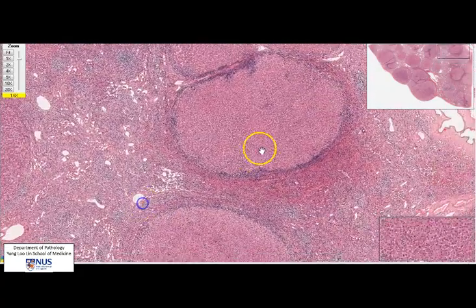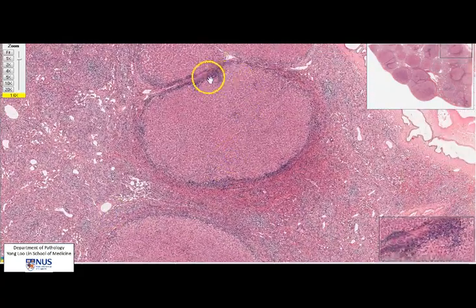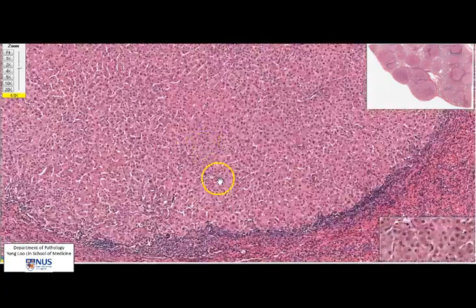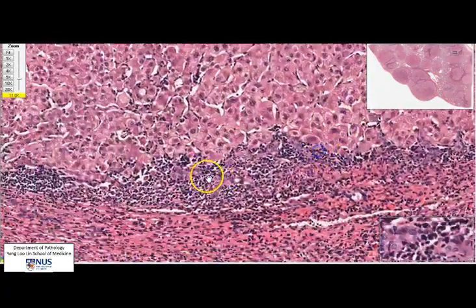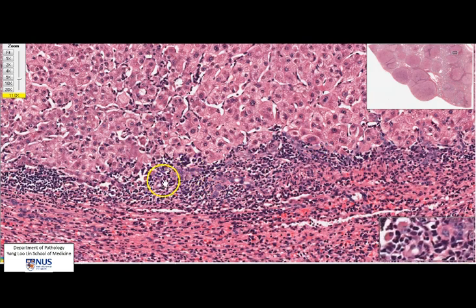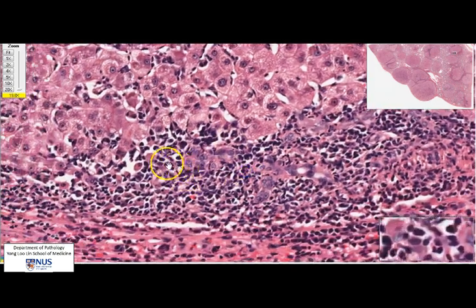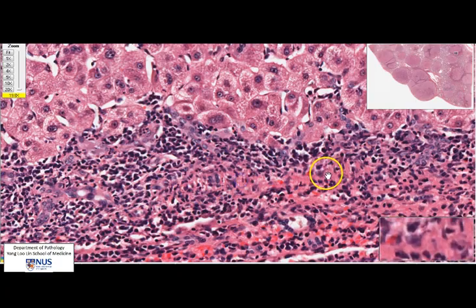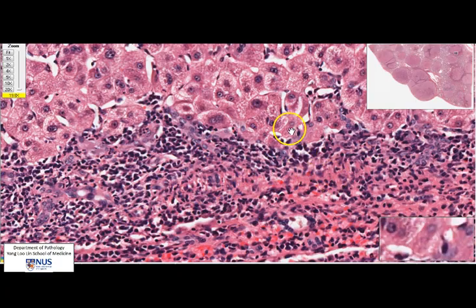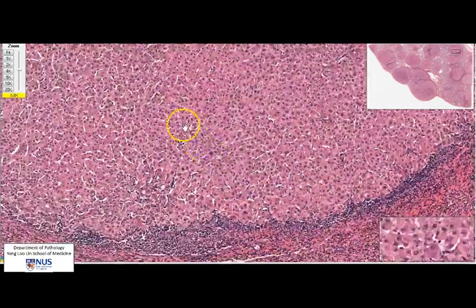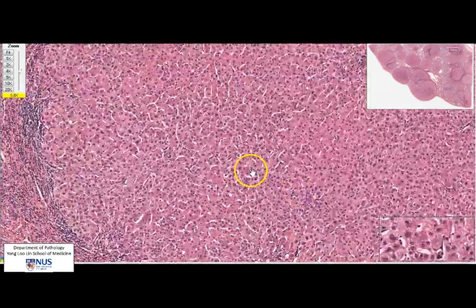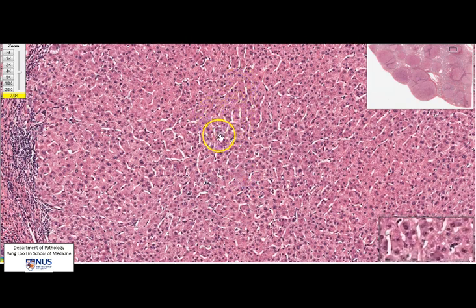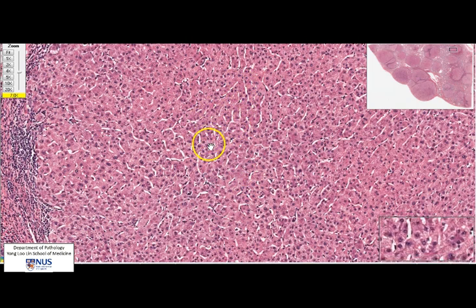Focusing on one of the nodules, you can see a little bit of a bluish edge around it, which is due to the accumulation of inflammatory cells. We have mostly lymphocytes present at the edge of the nodule. Within the nodule we can still appreciate the trabecular architecture of these plates of hepatocytes.